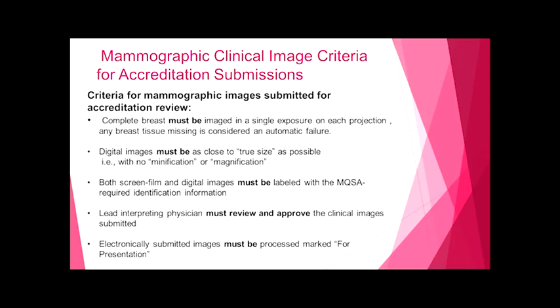I've done a couple of accreditations in the past where the facility did not pass because they didn't have the required identification on their films. And boy, that's a hard pill to swallow, when you have to back up and do all of that, and it had to do with required identification. The lead interpreting physician must review and approve the clinical images that are submitted. Electronically submitted images must be processed and marked for presentation purposes.